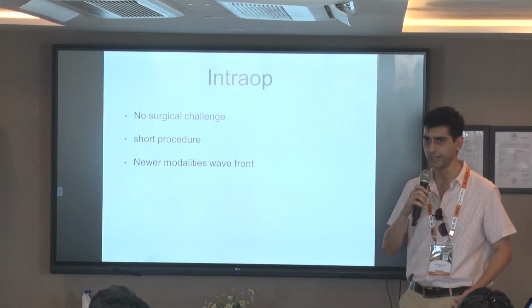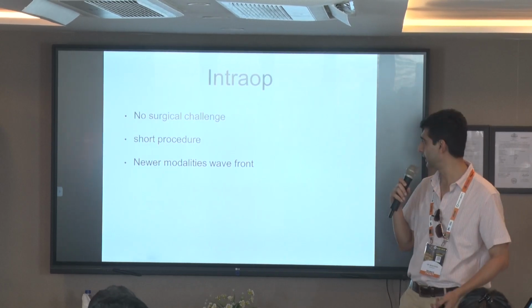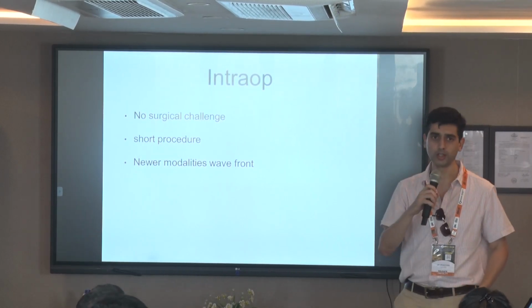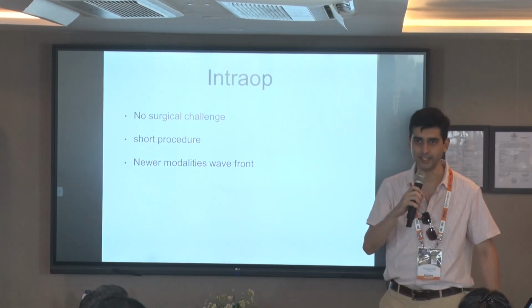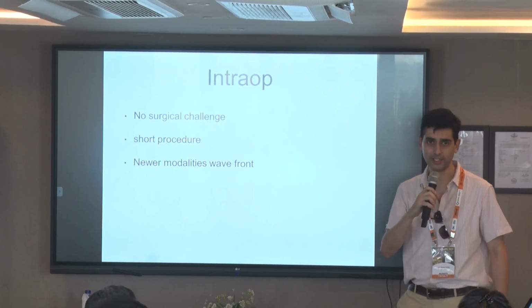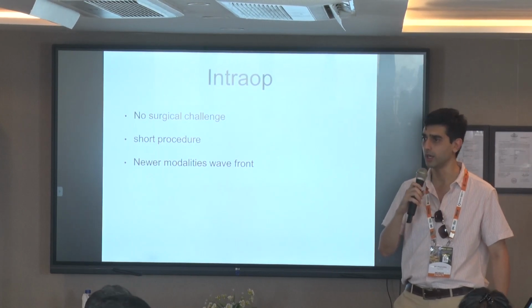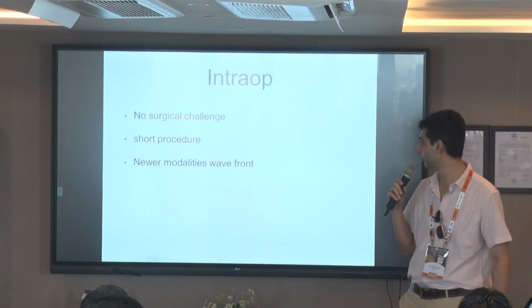You might take about 20 seconds to ablate, and now with the newer laser, you might ablate in about 5 to 6 seconds. So a sub 1 minute surgery can be done. And now with the newer modalities, I don't need to say that there are already people advertising a lot about that on Google and YouTube, and I don't have any financial interest. So people are also upselling the surface ablation by using newer and more fancier words.